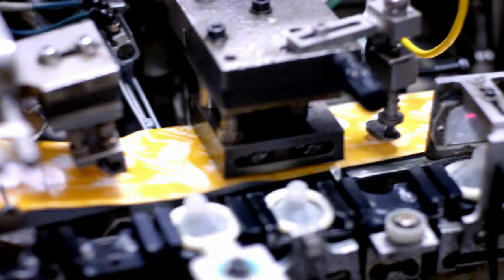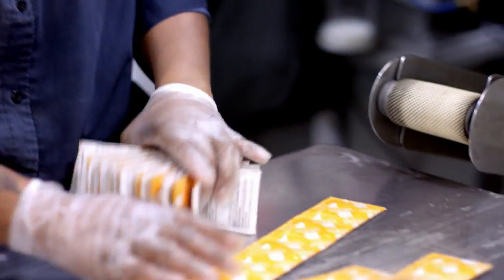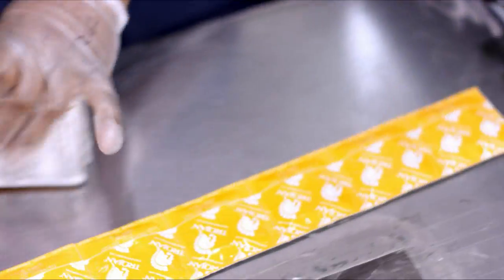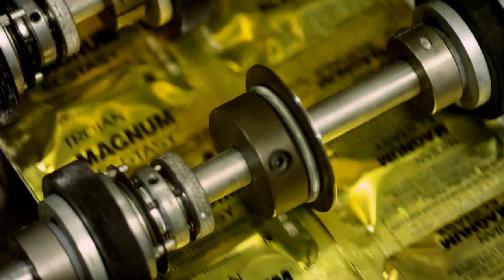Two opposing foil webs are heat-sealed together, forming the wrapper. The wrapper materials, which are carefully selected to meet stringent quality standards, are custom designed to protect the condoms and keep them safe.